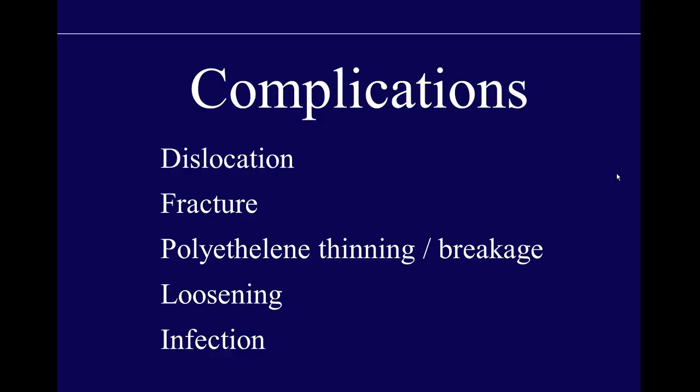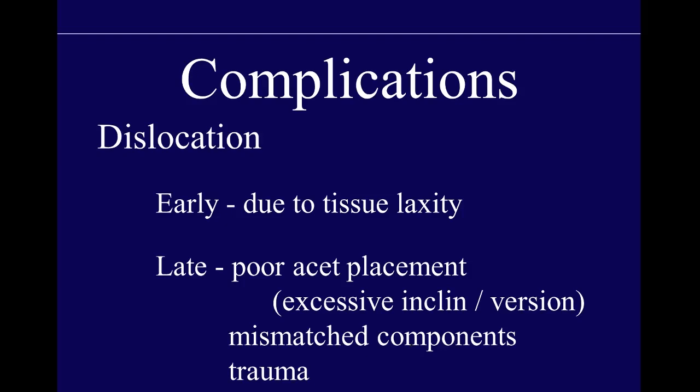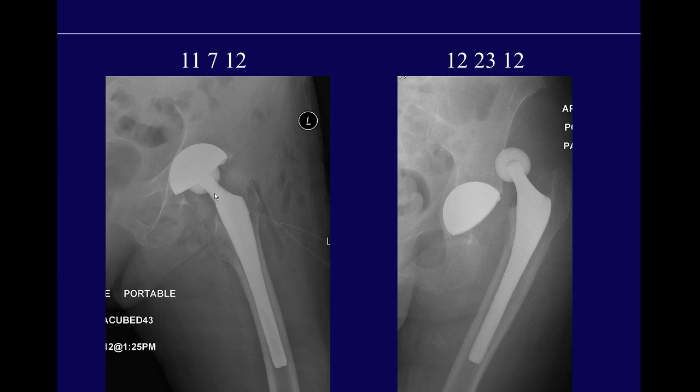Regarding complications: dislocations occurring early are typically due to tissue laxity in the immediate post-operative period, before the soft tissues have stiffened up. Late dislocations are typically due to poor acetabular placement — excessive inclination, anteversion, or retroversion — component mismatch such as a very large cup with a very small head, or trauma. Here's an example of an early dislocation: the immediate post-op study in November, and several weeks later the patient is dislocated because the soft tissue envelope has not yet stiffened enough to hold the prosthesis in place.